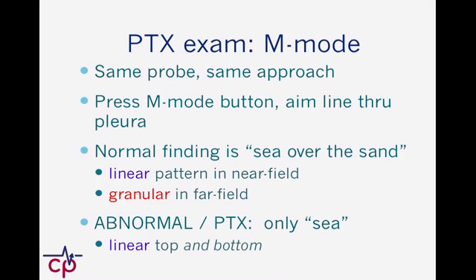And the way I remember this is I got to be a simpleton about this. The complex physics eludes me at the bedside when somebody's critically ill. And so what I need to think to myself is, do I want to be lost at sea, or do I want to be hanging out on the beach with a drink with a little umbrella in it? I want to be on the beach. I don't want to be lost at sea. So if I see the sea everywhere, that's bad. If I'm on the beach, that's good.